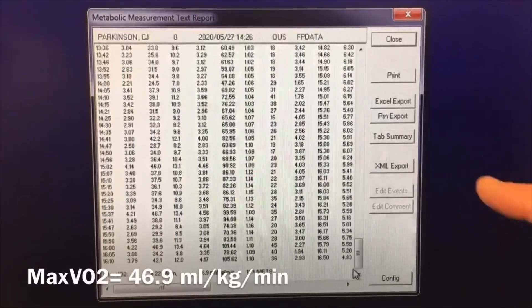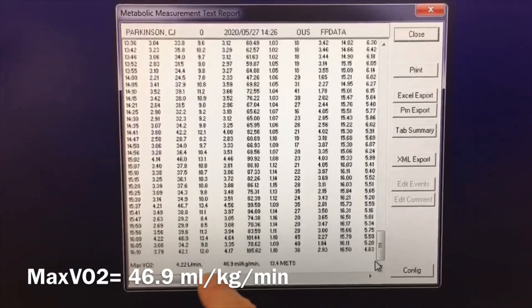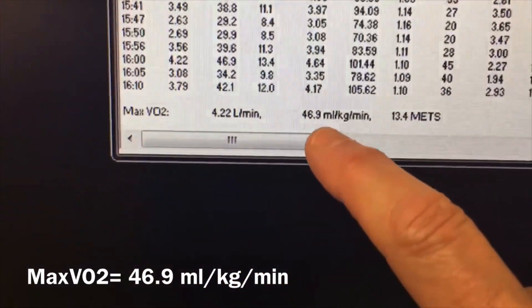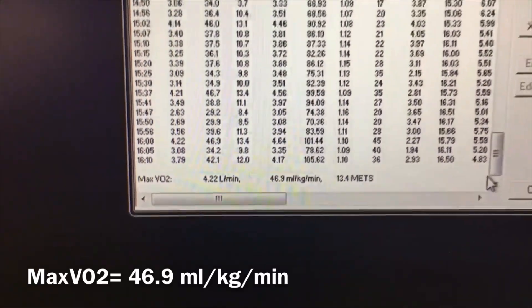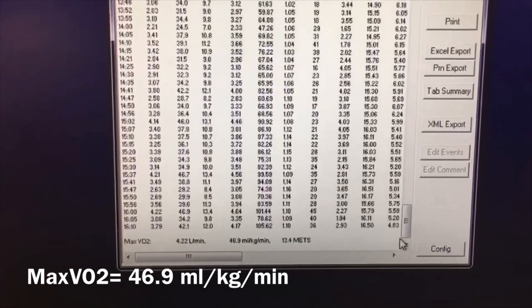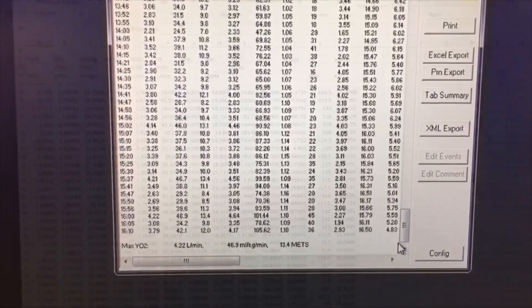We can look at the bottom of his report and it will show you that his maximum VO2 is 46.9 milliliters per kilogram per minute. It also shows liters per minute and METs, but we're going to be concerned with the milliliters per kilogram per minute.